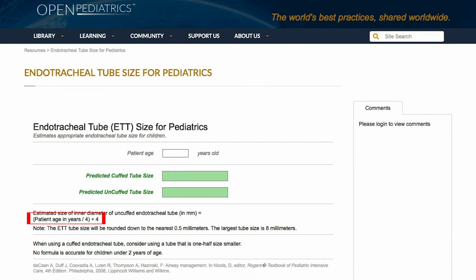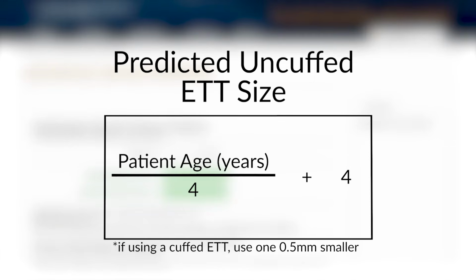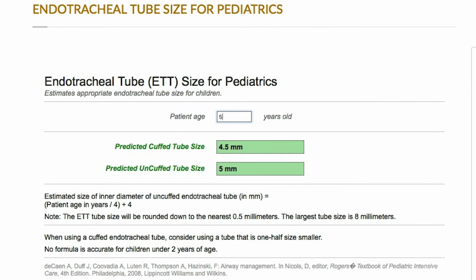The suggested endotracheal tube size and laryngoscope blade can be determined by the patient's age. The predicted correct endotracheal tube size can be calculated using commonly accepted formulas or by using electronic or print references for resuscitation. Identifying and becoming familiar with a given approach to endotracheal tube selection in advance can help reduce the cognitive load during this high-stakes clinical procedure.